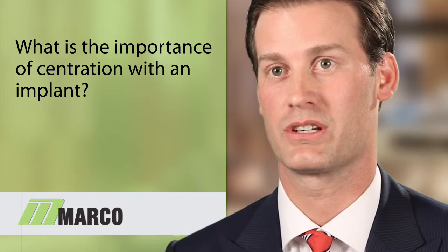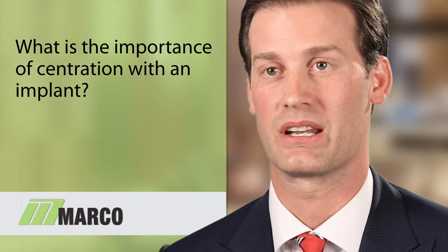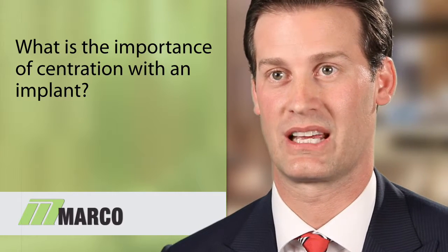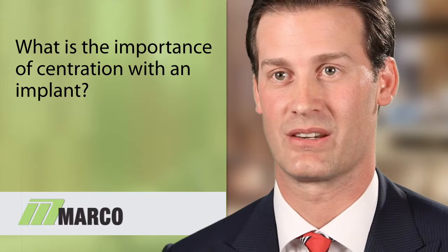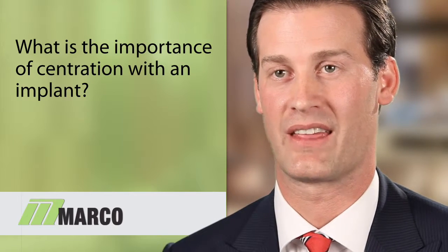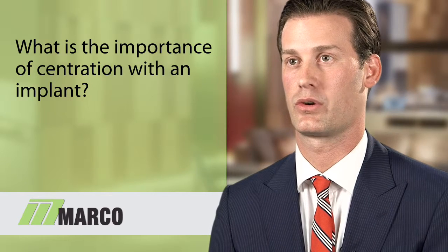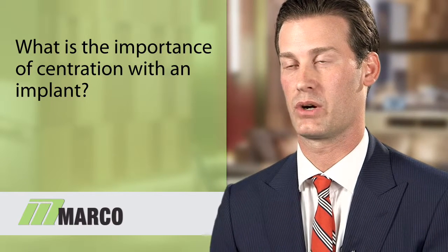And if you choose to do an implant of that variety, I would certainly make a strong argument for paying a little extra special attention to how you address that individual at the time of surgery. And that is an imperative part of the surgical workup that in most instances can only be evaluated with the OPD-3.